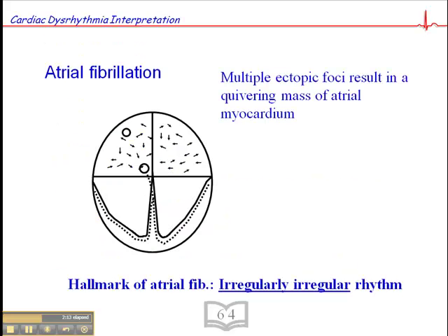In atrial fib, there are multiple ectopic foci. Re-entry — which we talked about earlier when I discussed PSVT — is the most common mechanism behind these multiple ectopic foci in the atria. There are so many ectopic foci that when one of these impulses sends off a wave of depolarization and encounters another one, the two waves of depolarization cancel one another out.